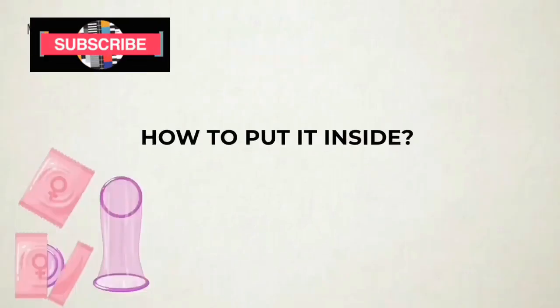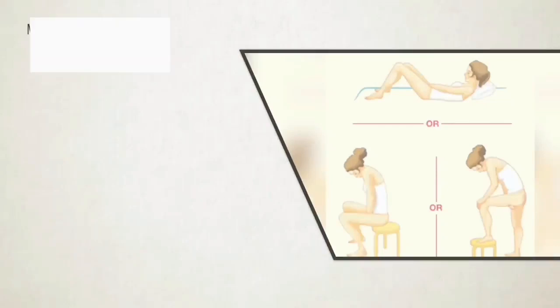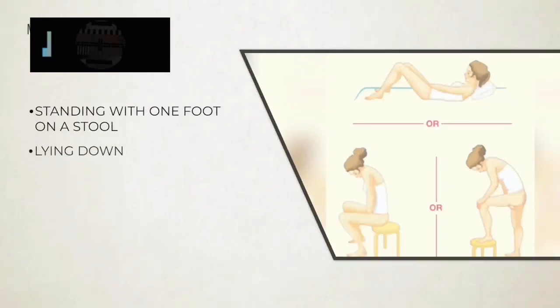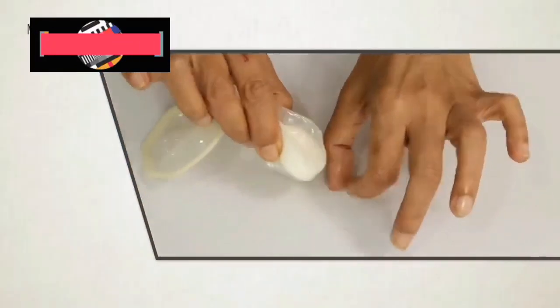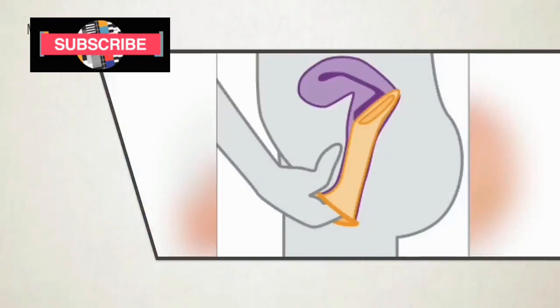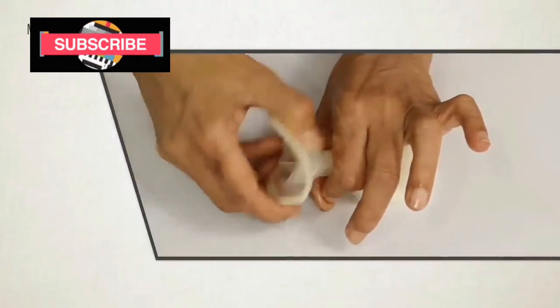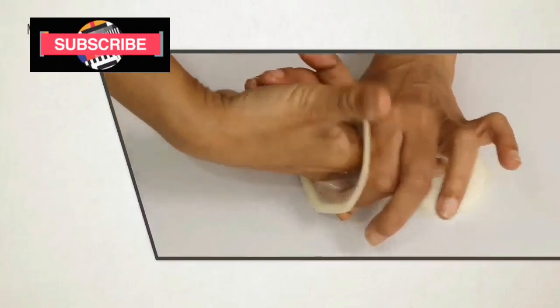Now, how to put it inside? You can use any comfortable position that you wish. For instance, you can stand with one foot on a stool, or you can choose to lie down or squat. Now, squeeze the inner ring and slide it carefully inside to cover the wall of the vagina. Now, push the inner ring inside the vagina as far as it can go. Make sure that the condom is not twisted. You can put your finger inside and push it to go deeper.